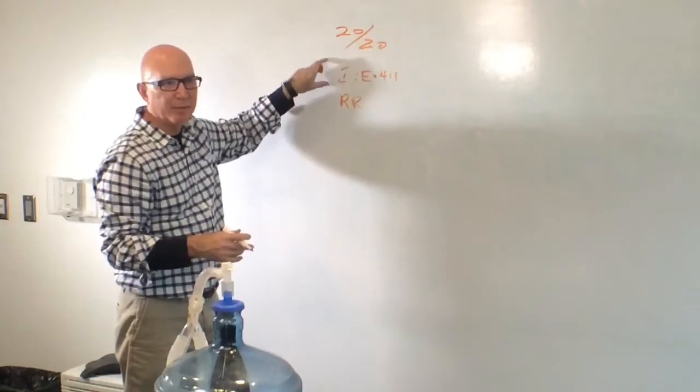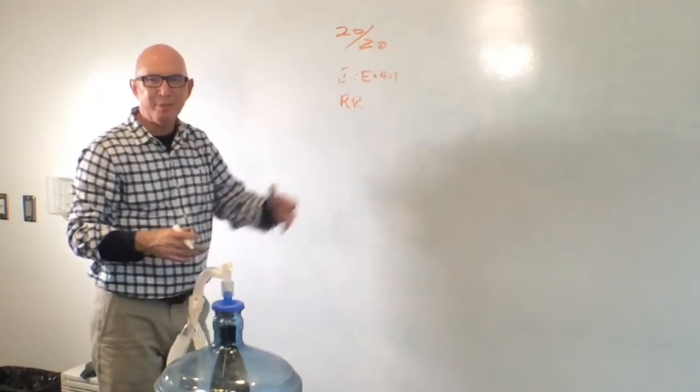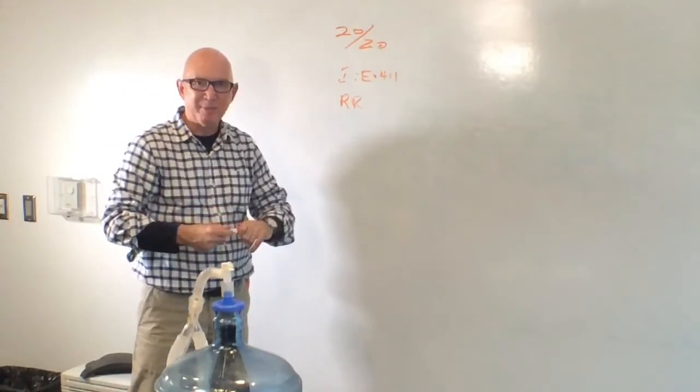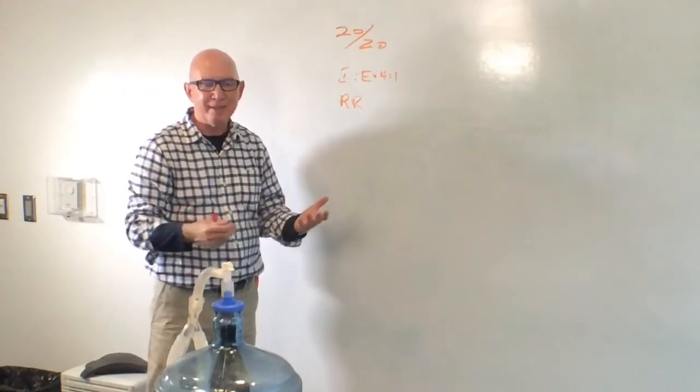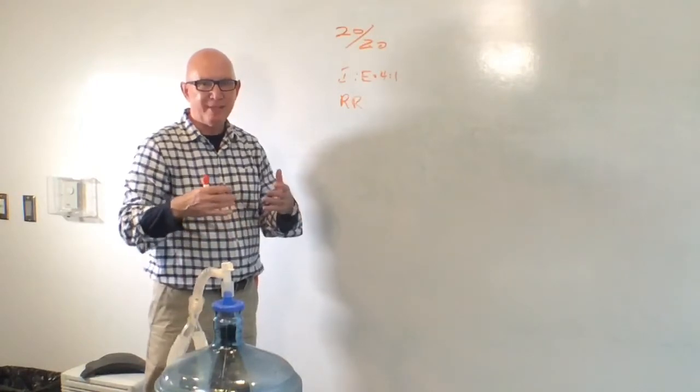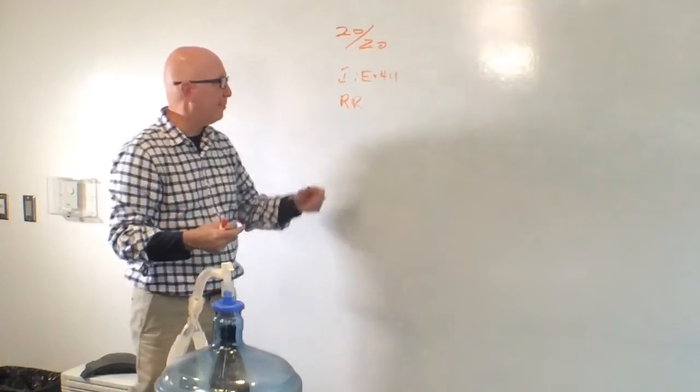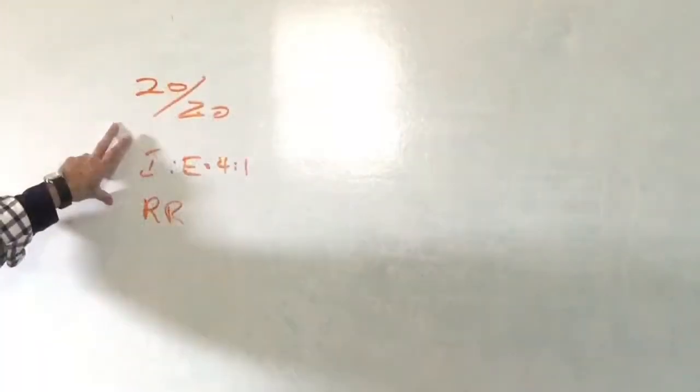and this is for the ARDS patient again, remember, because not every hypoxemic patient needs a recruit maneuver, because not all of them are hypoxemic because they have consolidated lung. And so it needs to be a patient who actually has a diagnosis of ARDS, and that pathology is when we would use this maneuver.